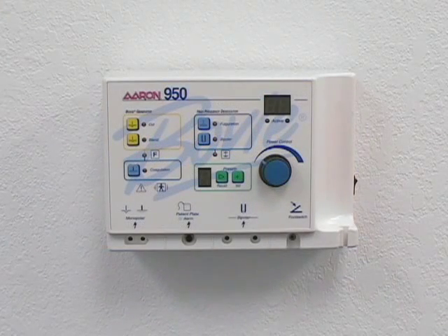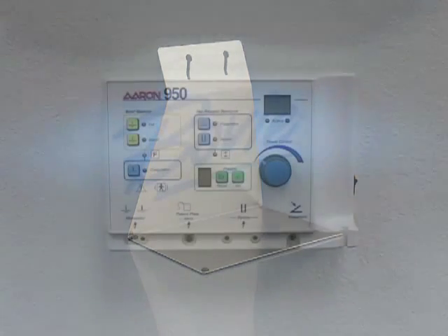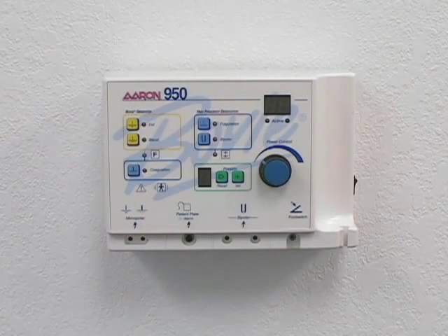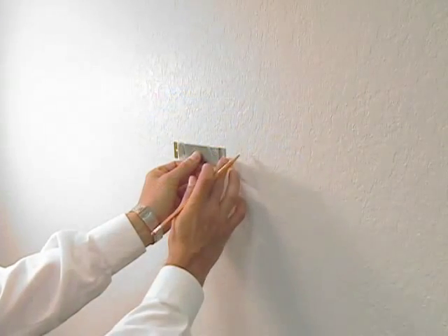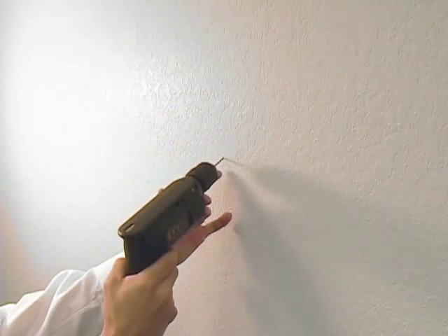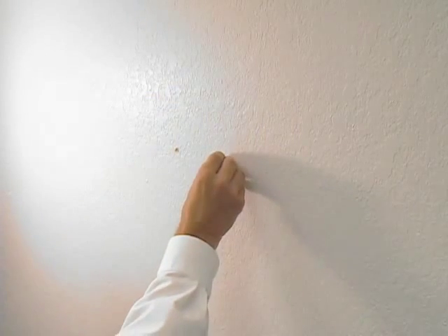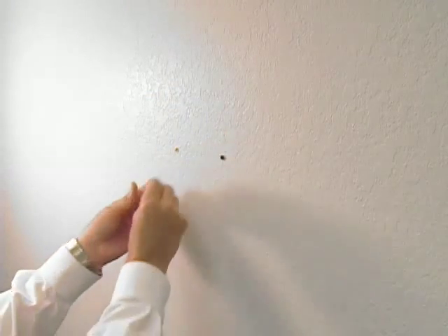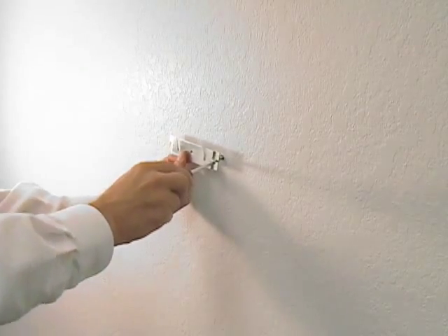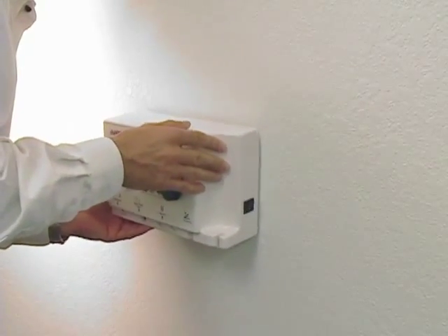The Aaron 950 can be mounted on the wall, a mobile stand, or a tabletop stand. In order to mount the Aaron 950 on the wall, use the following procedure: mark the drill holes using the bracket as a guide, drill out the holes using the 3/16 drill bit, seat the screw anchors into the holes, insert the screws through the bracket into the anchors, then slide the mounting screws into the grooves on the bracket.